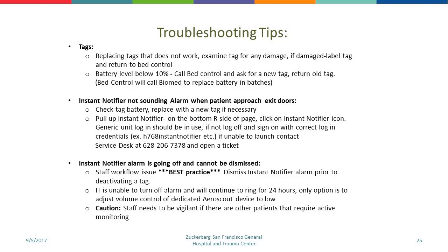Instant notifier alarm not sounding off when a patient approaches exit doors. Check the tag battery. Replace as necessary. Pull up instant notifier on the bottom right-hand side of the page. Login should be the unit name, for example H768 instant notifier. If staff Active Directory is logged in, please log off and use your unit's generic login.